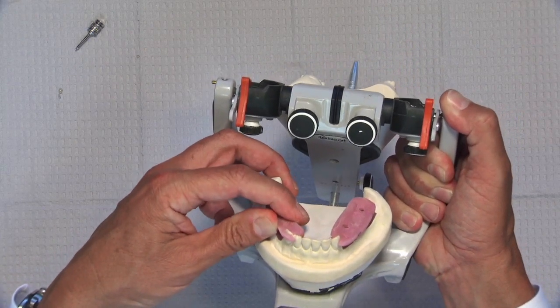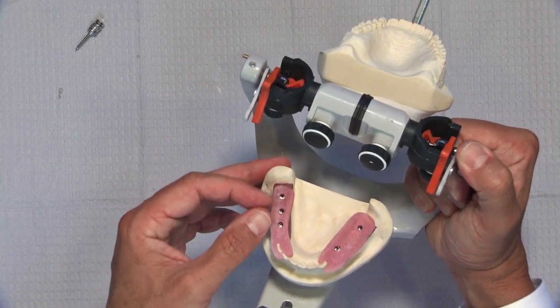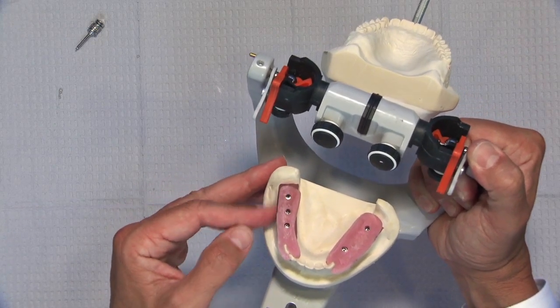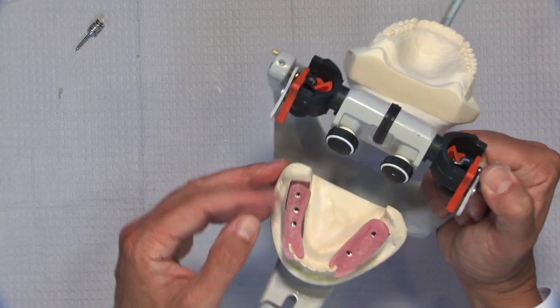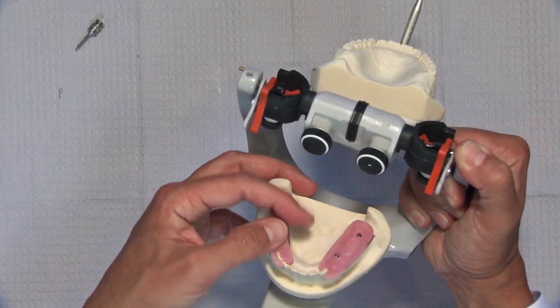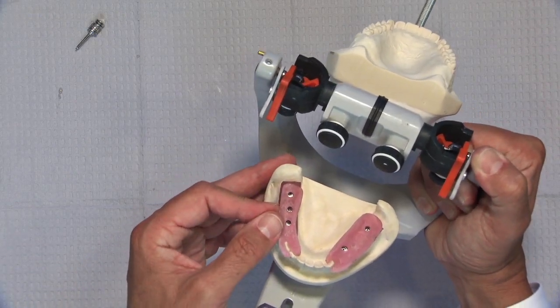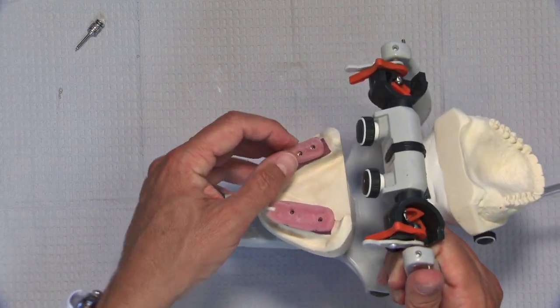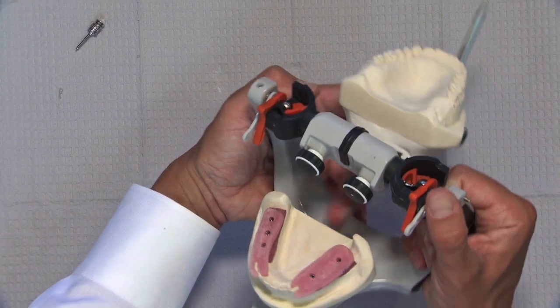When you compare this to a typical bite block that we use in removable, or even in crown and bridge, just trying to take a bite registration of an edentulous space, a mush bite as it's sometimes called, this is just a huge jump ahead, light years ahead in terms of accuracy, and you can see why we're hopefully going to need very few adjustments when we go to finally put the case in place, because we've got this nice stiff platform that we're going to use for our bite registration.